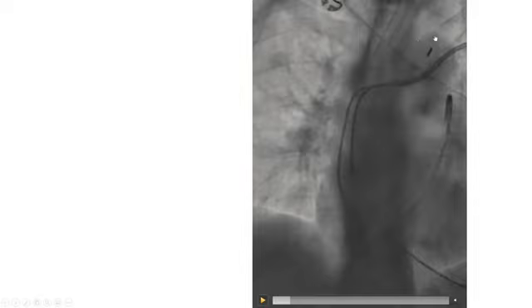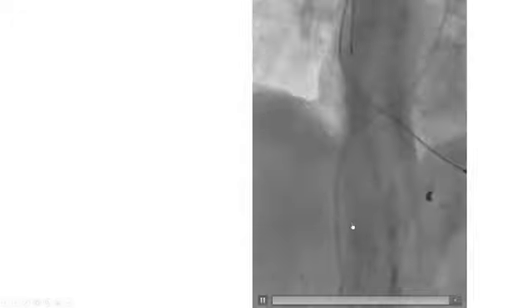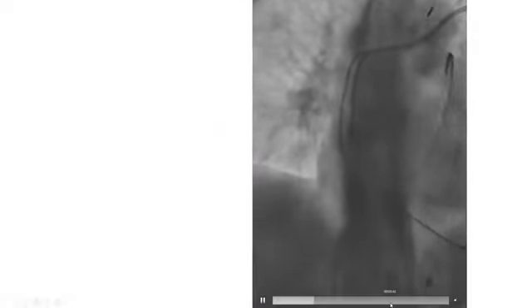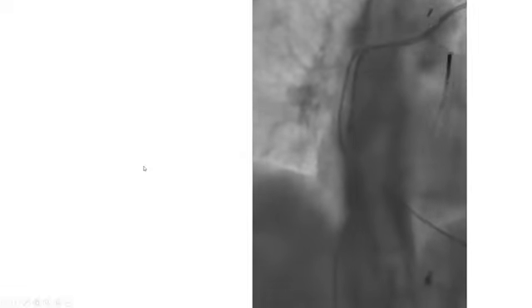It should be below it, but more so than that. This is almost at the top of it. So it should be somewhere here. This balloon is a little too high. And you can look distally here where the marker is. This is the rib. And this is a little too low, but again, sometimes you have to accept it. You can see here, this is L1 and this is L2. And it's a little below L2.